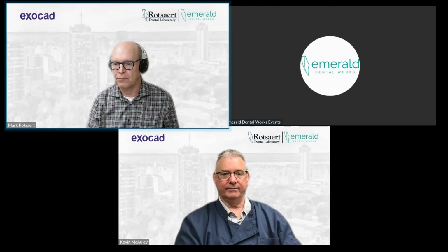Okay. We'll do this last question. When aligning scans, I think this is where this question's going. When aligning scans, is the intraoral scan the same accuracy as a CBCT scan, or are there slight variations from one scanner to each scanner? Oh, great question.